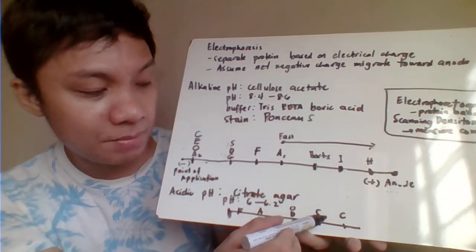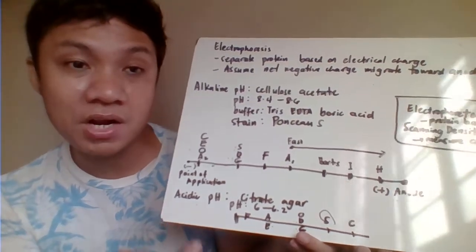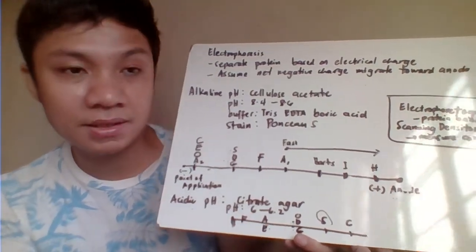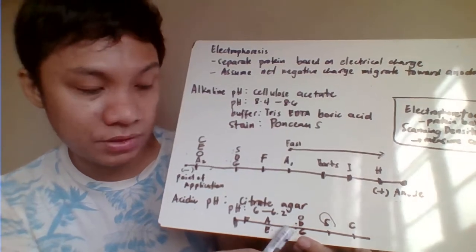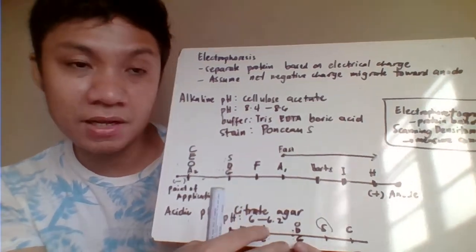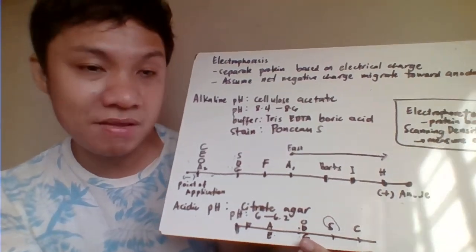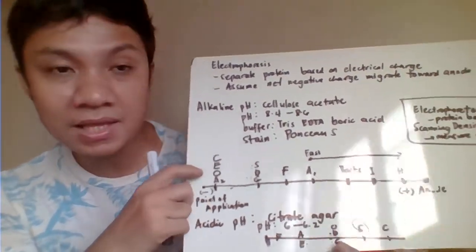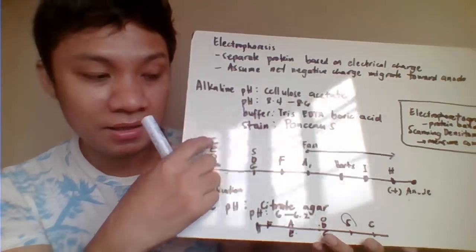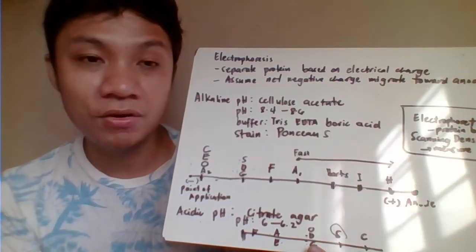And so we can separate hemoglobin S with that one. But still, your D and G still migrate together. You can further perform other tests to really differentiate whether it is hemoglobin D or G. But subjecting from your alkaline pH to your acidic pH electrophoresis will help you specifically differentiate those significant hemoglobinopathies, especially if they tend to migrate on the same protein band. Since they migrate to the same protein band in this agar, you can further separate them by subjecting it to your acidic pH.